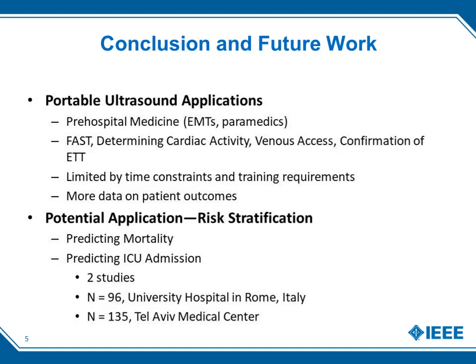Both Europe and Taiwan have conducted studies regarding pre-hospital ultrasound and found that they did indeed change emergency management. They also concluded that training requirements and time limitations were the biggest constraints. More data is needed in regards to whether or not pre-hospital ultrasound can actually affect and improve patient outcomes.